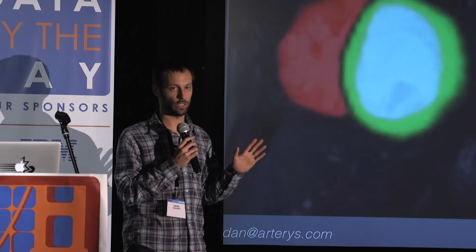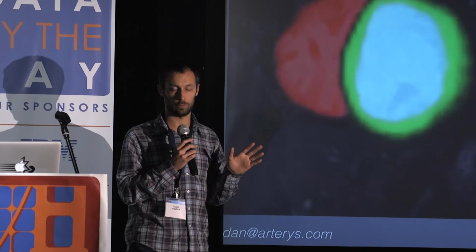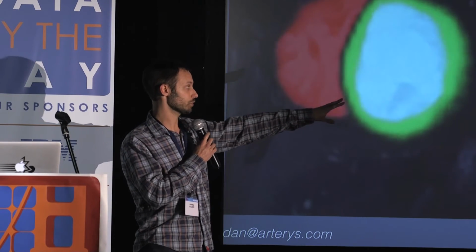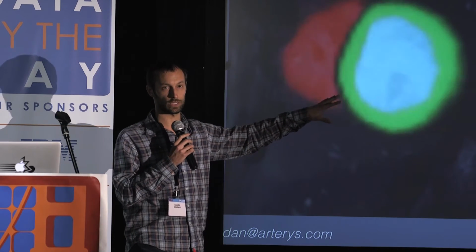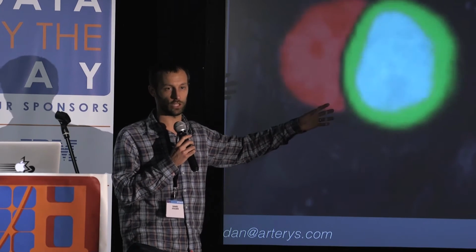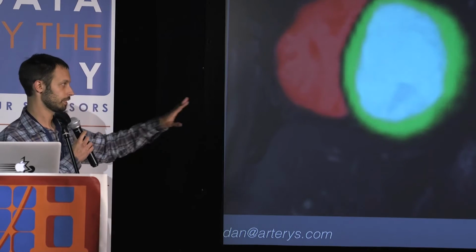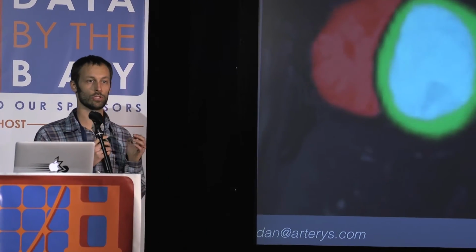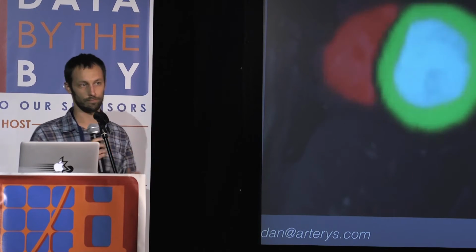You're not going to get in trouble with the FDA because the radiologist has the opportunity to fix anything that went wrong, but the radiologist needs to do much less work in this case to get to an acceptable segmentation and an accurate volume estimation. So that's a big advantage of this technique and why we really want to make it very accurate to ensure they have to do as little work as possible.